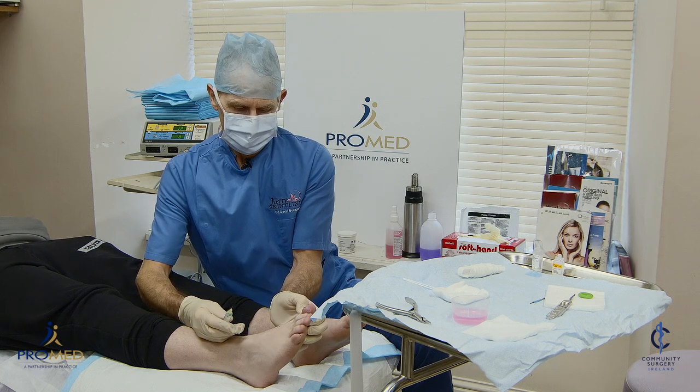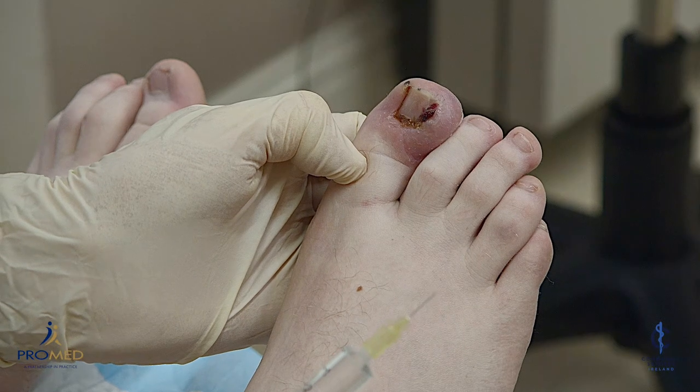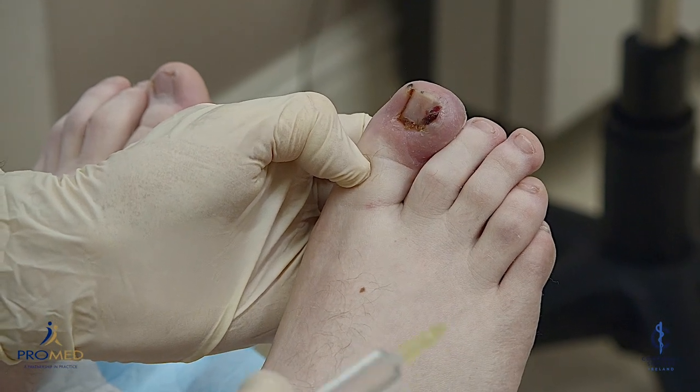I have five mls of local anaesthetic. I'm going to make a bit of pressure with my finger first. Now you're going to feel a pinch, Scott.